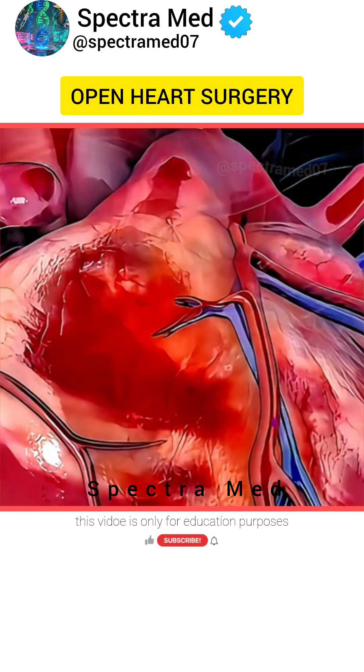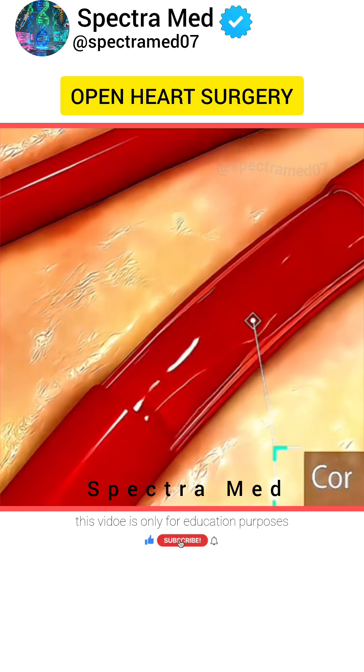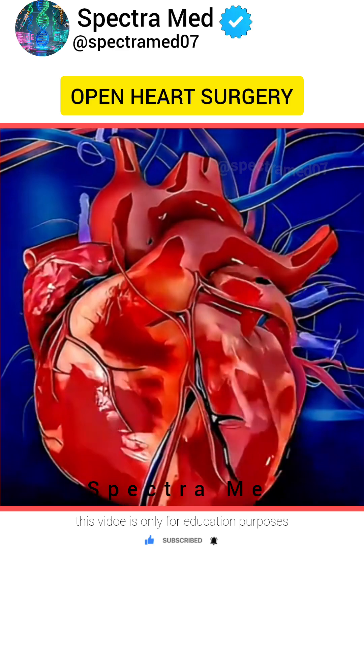Ever wondered how open-heart surgery works? This life-saving procedure, known as coronary artery bypass surgery, is performed when arteries that supply blood to the heart become blocked. So let's see how it's done.